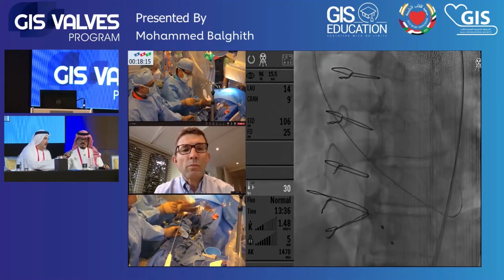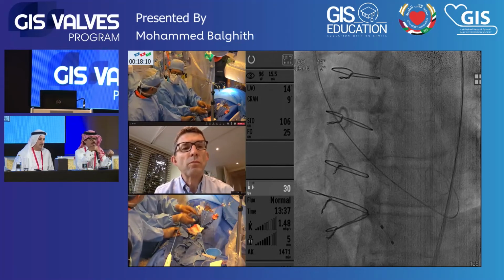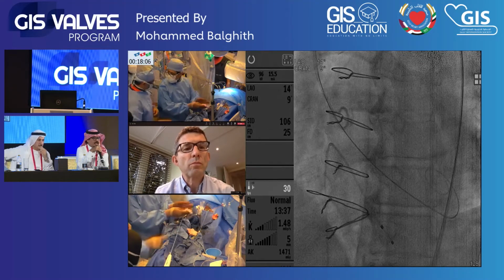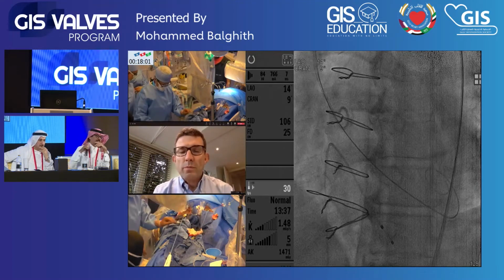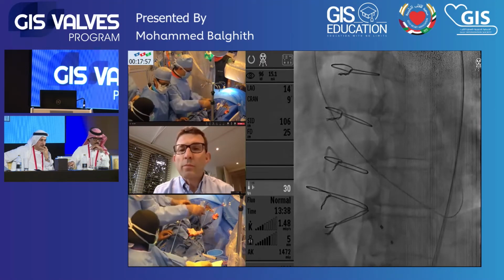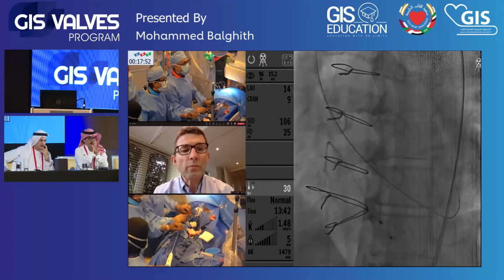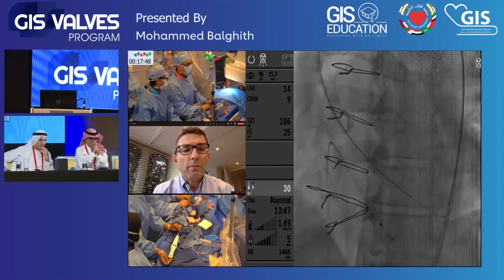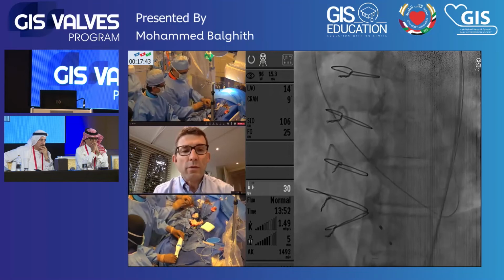Okay, now. Actually, there was a lot of calcification in the right femoral bifurcation, in the iliac with the aorta. That's why you had some resistance, but it went okay after that. We can push more, right? Go ahead. Yeah, go to the end. It's going easily. Very good. It's more flexible. Okay, go ahead.